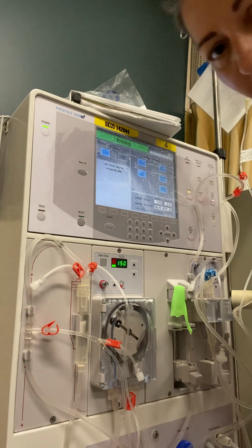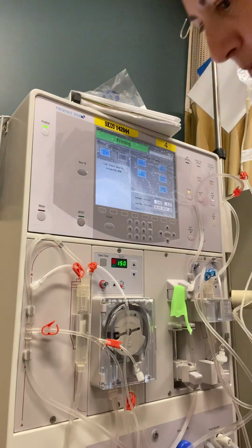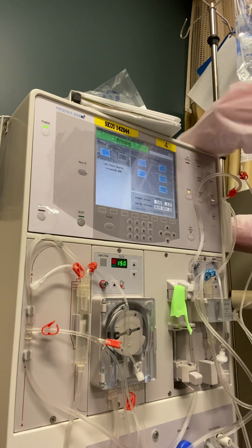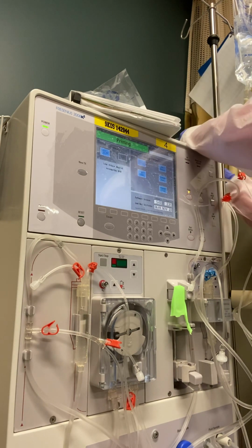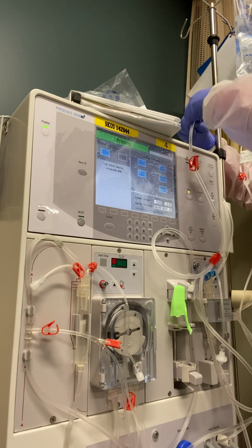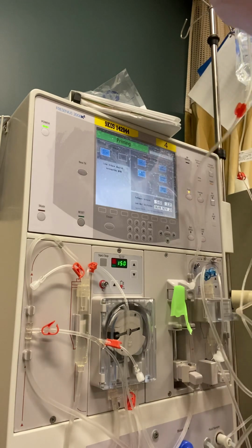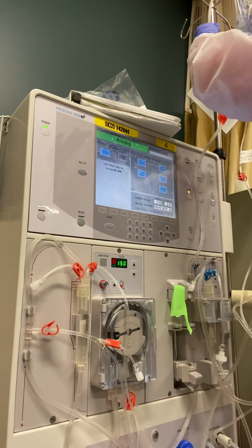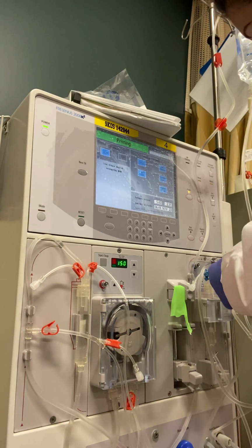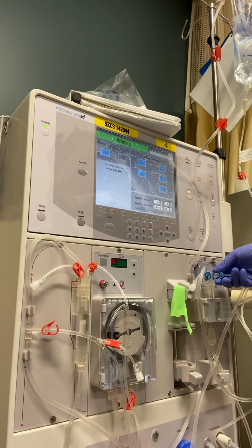So I'm going to go ahead and cut it short because I can tell that there's no bubbles left in the tubing. So I'm going to stop the pump, clamp the large blue clamp, and then I'm going to marry the red and the blue blood tubing. Hang them up, unclamp them. Then I'm going to fill the venous drip chamber by opening the transducer line.